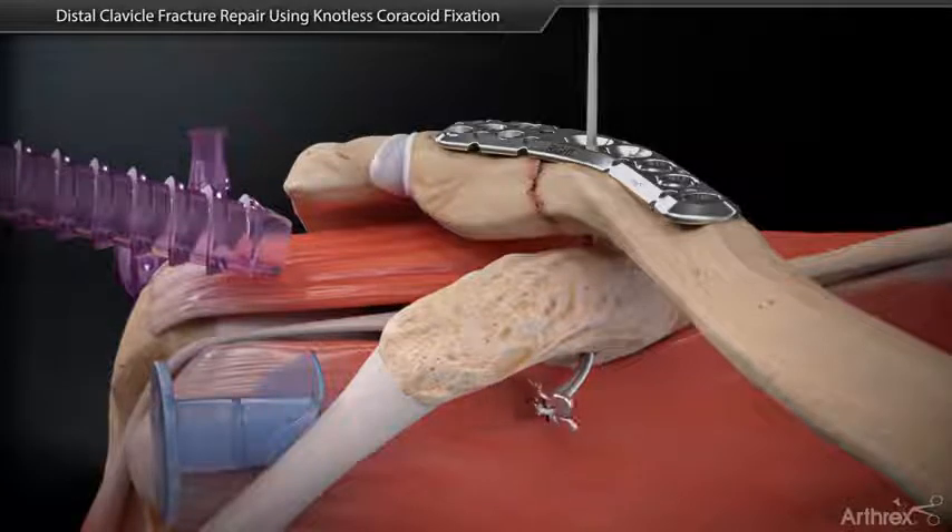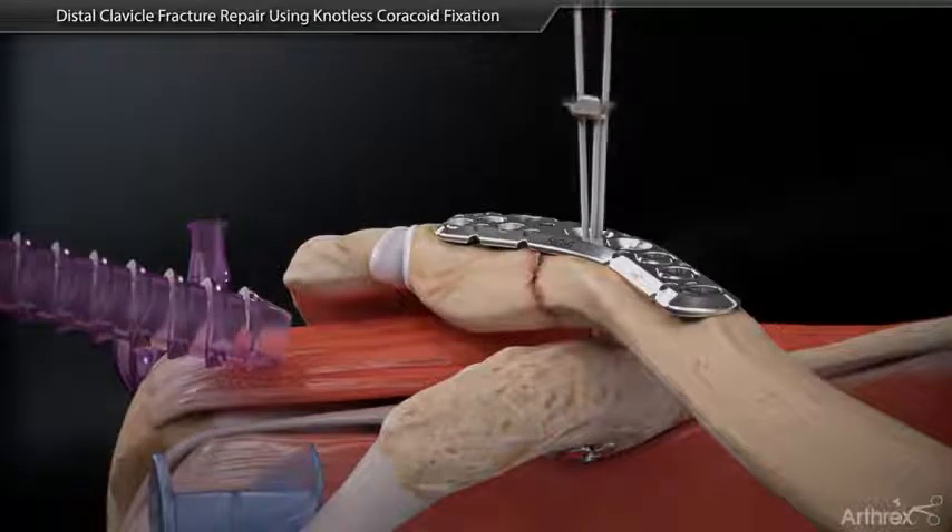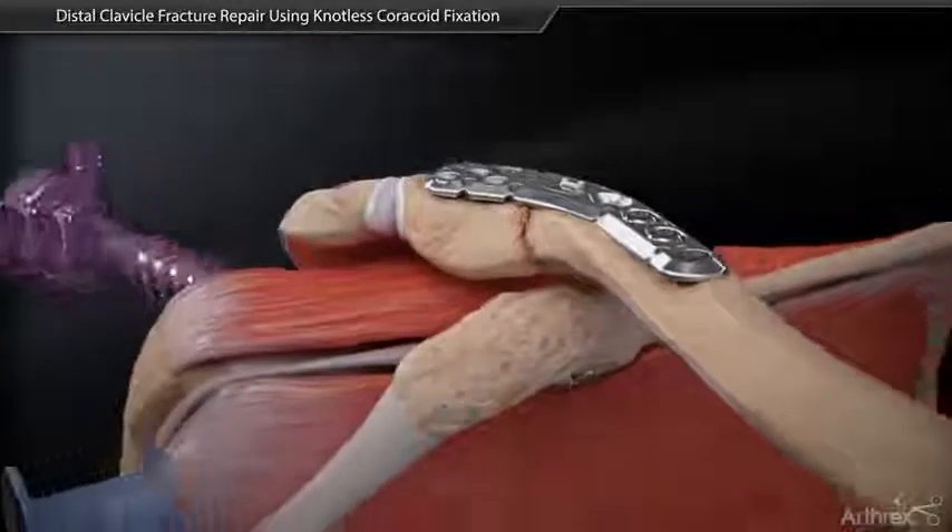Shuttle the knotless tightrope loops through the bone tunnels and attach a dog bone button to the loops. Shuttle the loops until the dog bone button seats at the base of the coracoid. Cinch the self-locking tightrope loops until the plate button seats into the plate. Cut the free suture limbs to complete the knotless repair.